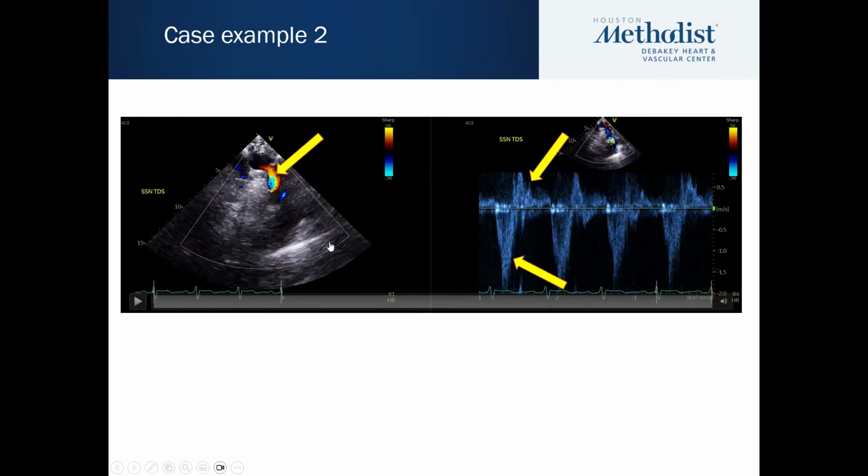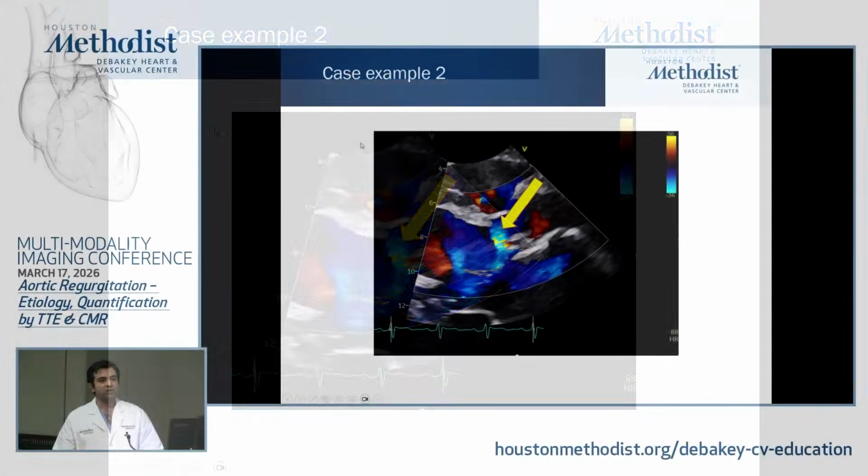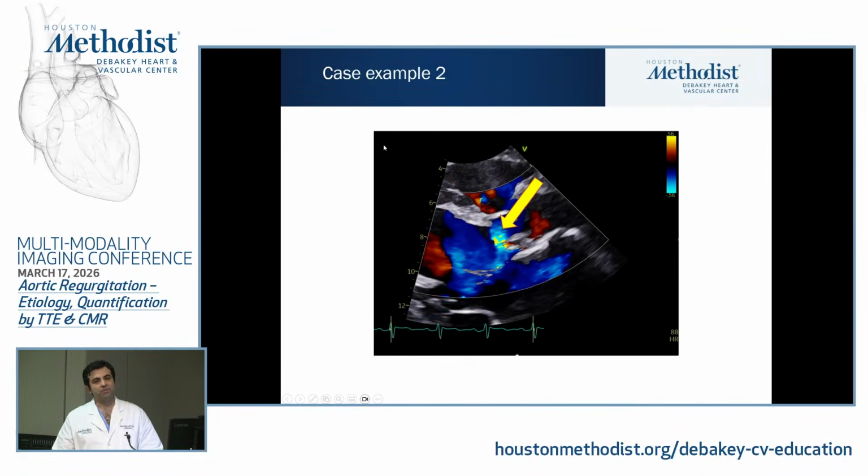With a big box like that, what's the range of temporal resolution versus a small box? It displays it here on the upper top, what you end up with. But it's highly variable because it's the size of the box and the depth. So I don't know off the top of my head what numbers you get. But visually, this looks almost like 90 or 100 milliseconds. It's almost like you're just getting three pictures of color.